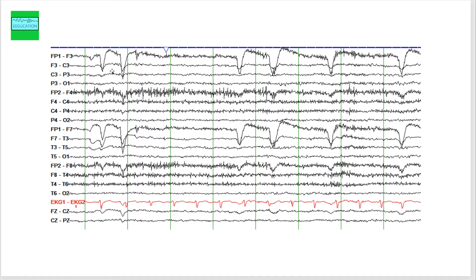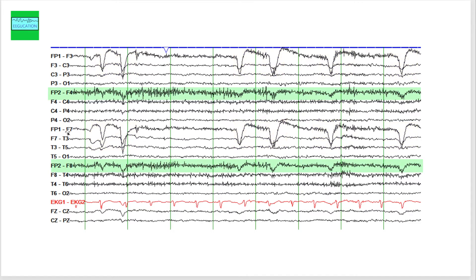You can see the eye blink artifacts on the left side, but you are not able to see the eye blink artifacts on the right side. Again, compare this channel with this channel, and you see an asymmetry in the eye blink artifact.